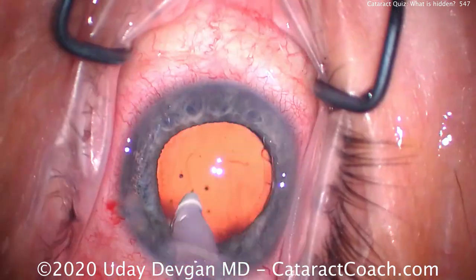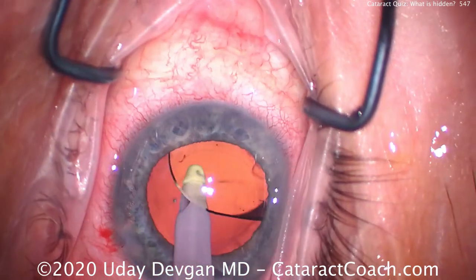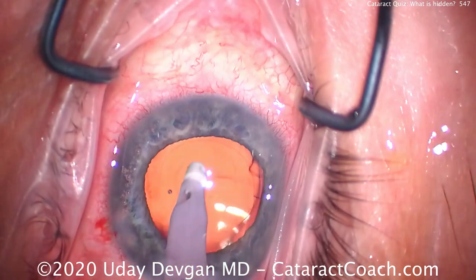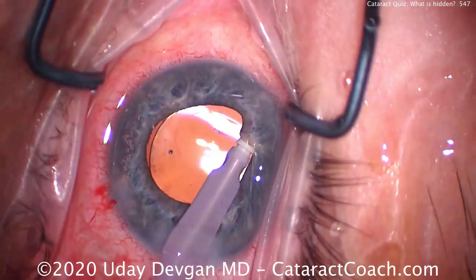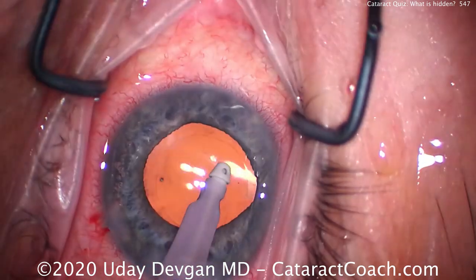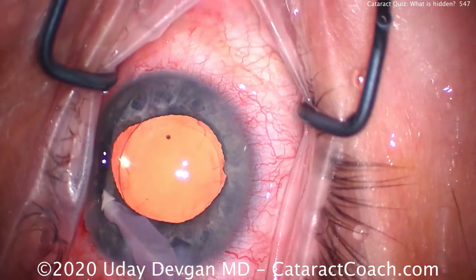The most common case when you see this is with a blue iris — the piece tends to hide a little bit more. A little less so with a brown iris because there's more contrast. Small pupil cases, shallower anterior chambers — if you break the cataract into more pieces with the chopper, chopping it into many small pieces, you've got to be careful and look out for that at end of case. This goes great — we let go of that iris after a little inadvertent grab, and we see a nice overlap of the optic by the rhexis. That's a beautiful case.